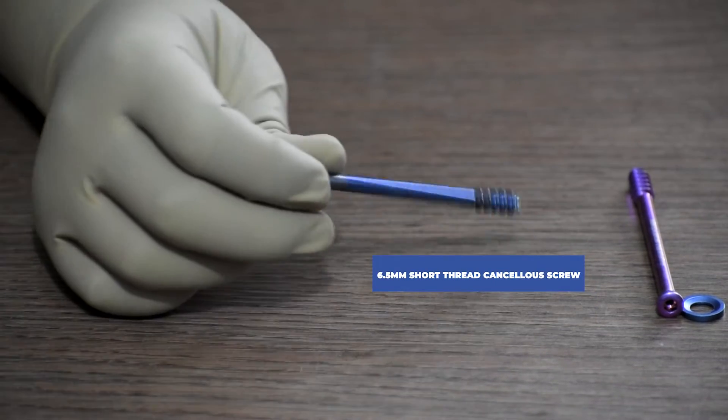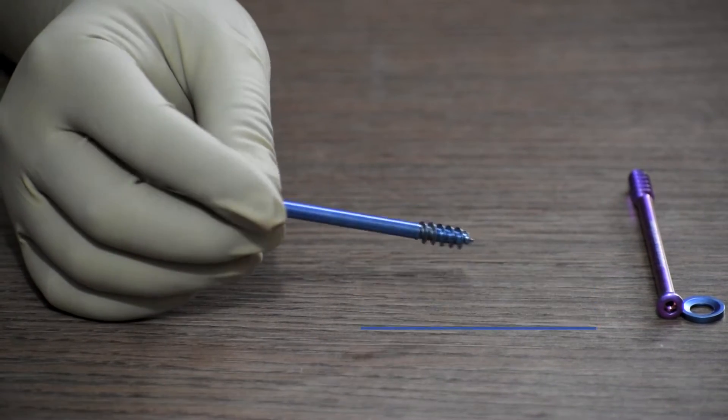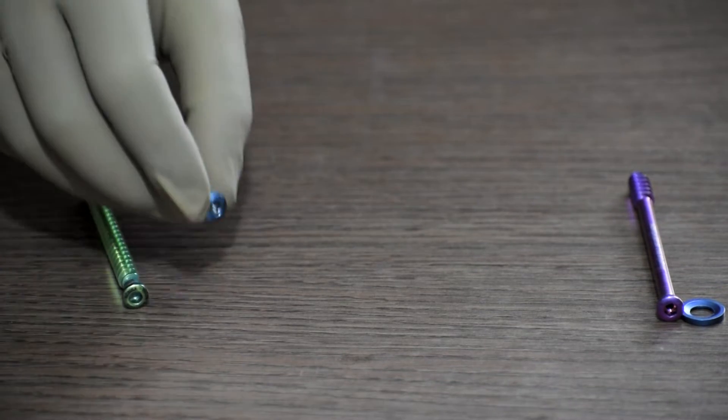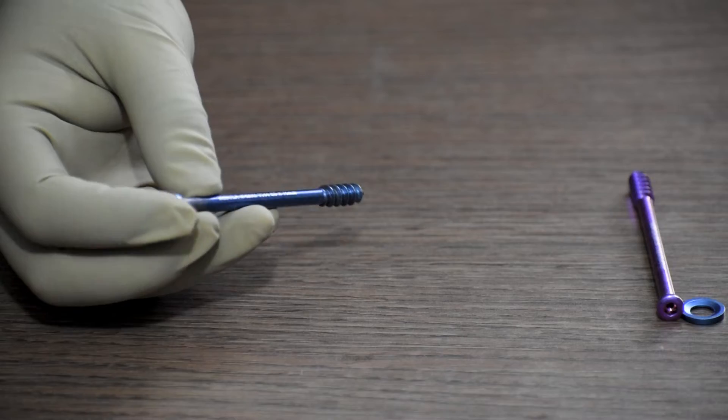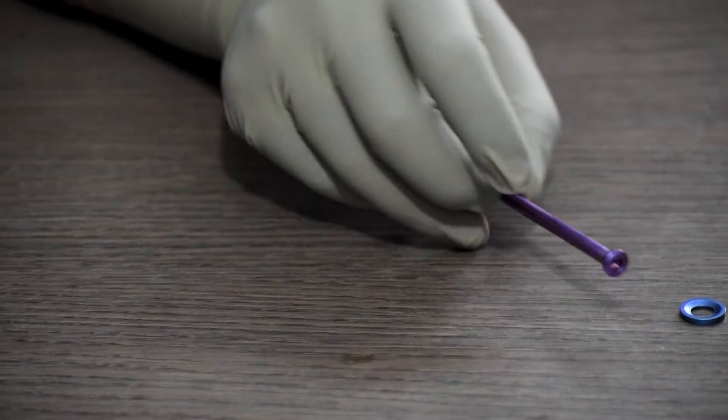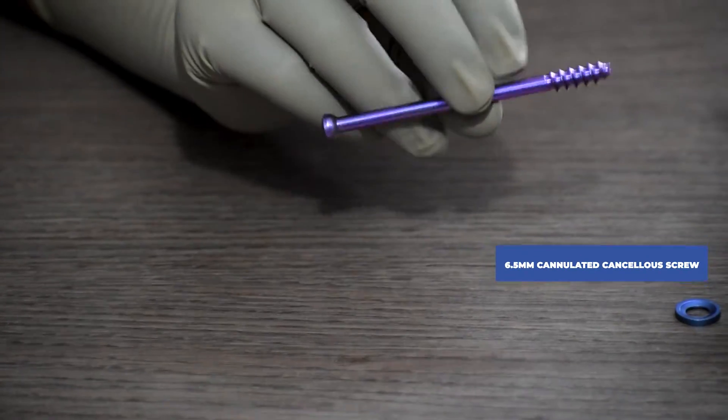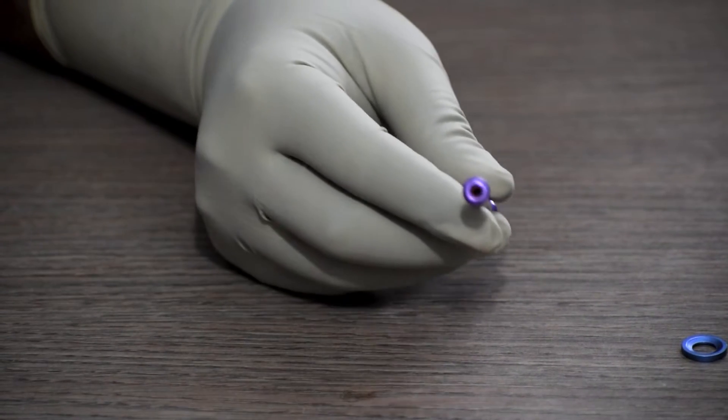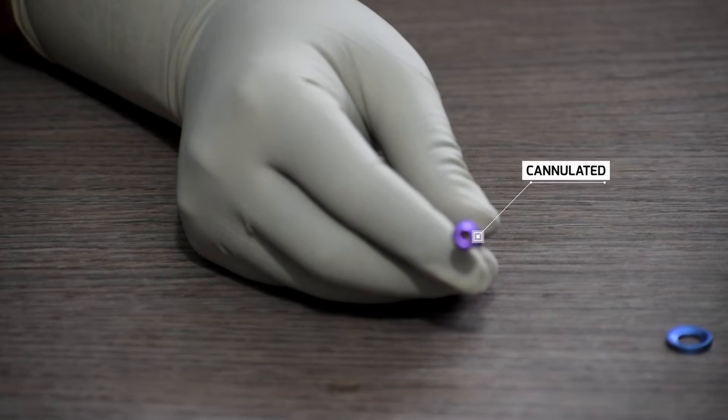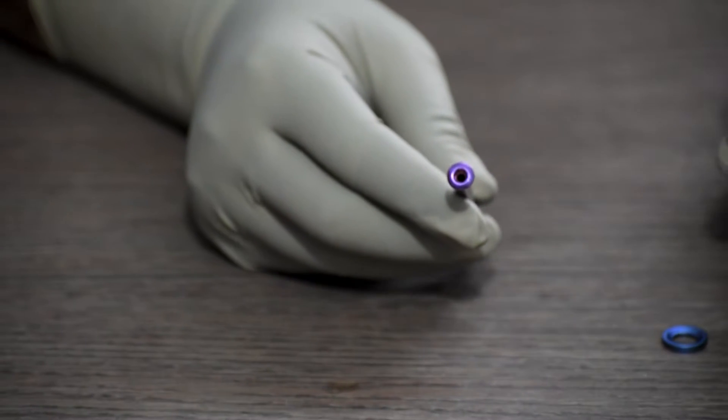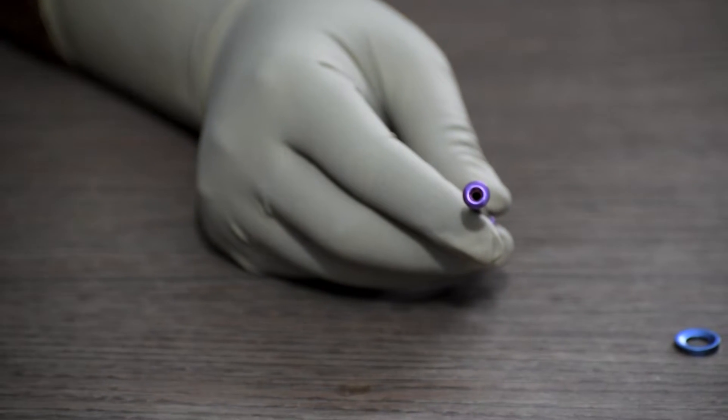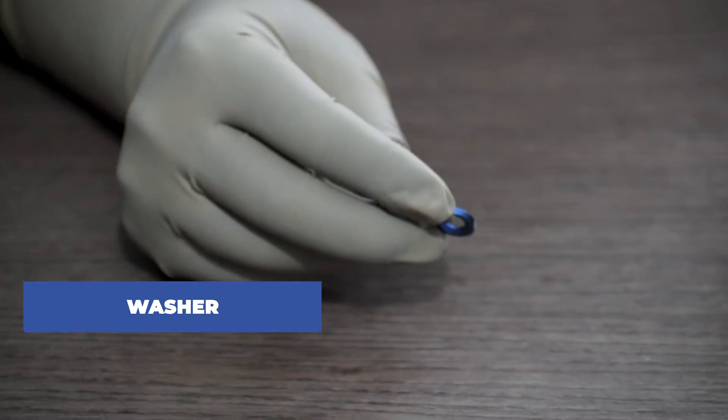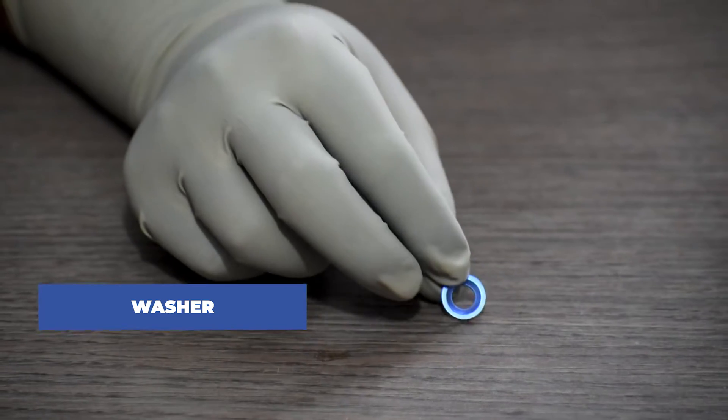This one is a 6.5mm short thread cancellous screw with 16mm thread. As you can see, this screw is cannulated, which means it has a hollow central shaft. Washer is provided with all the screws that helps in better compression.